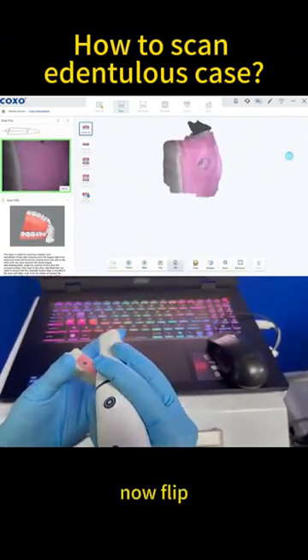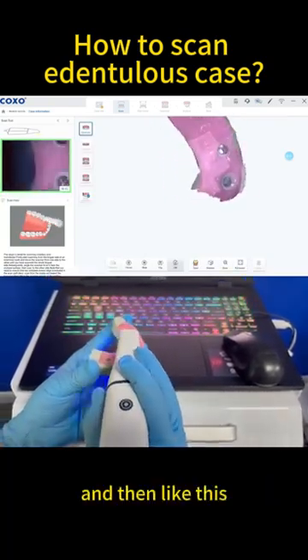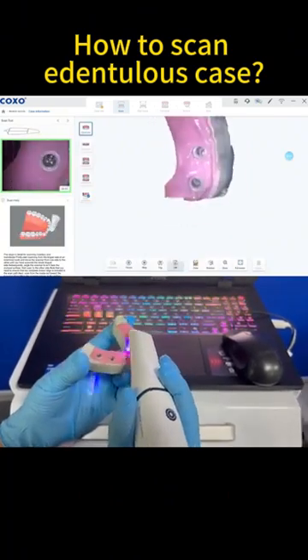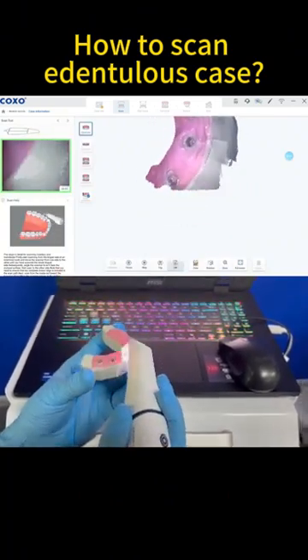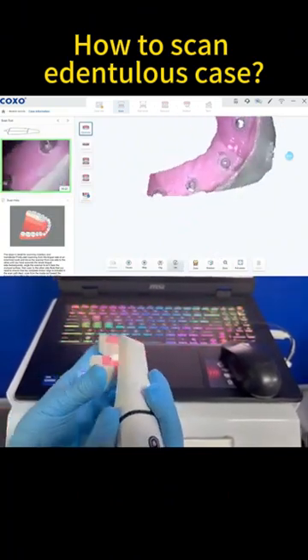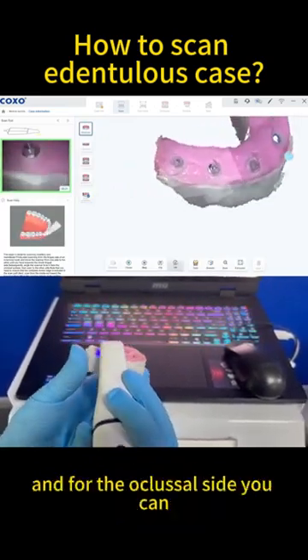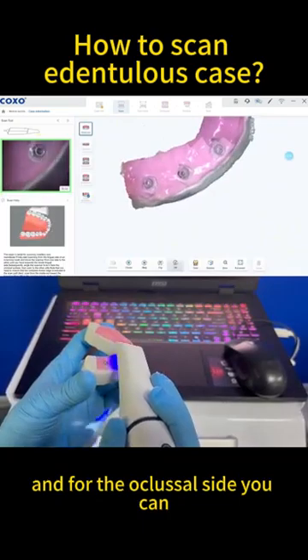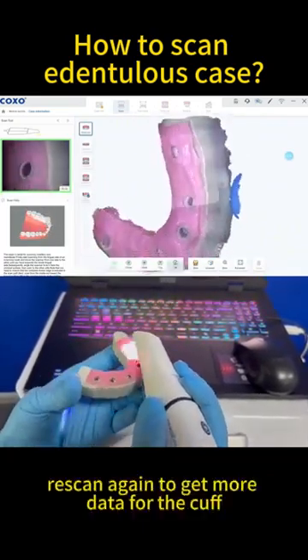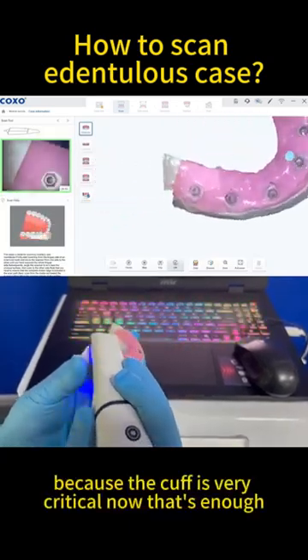Now flip — flip to get the data of the curve, like this. Move stably and slowly to make sure all the data is scanned. For the sides, you can re-scan again to get more data for the curve, because the curve is very critical.